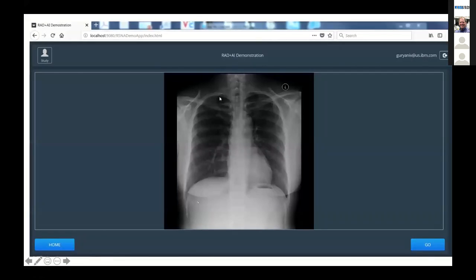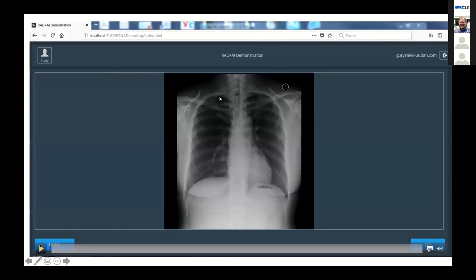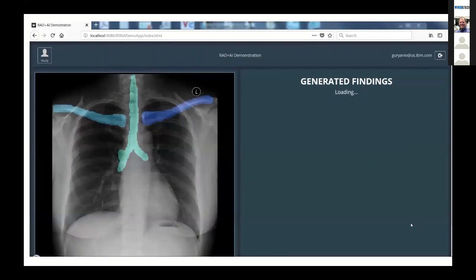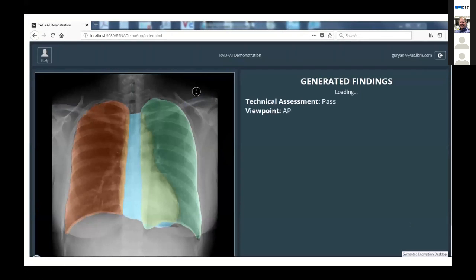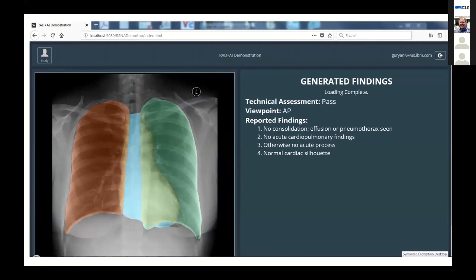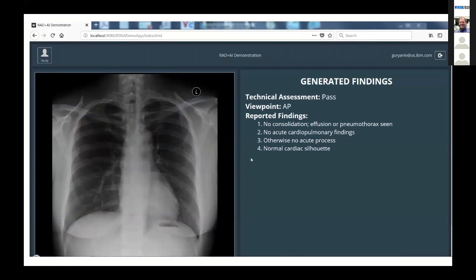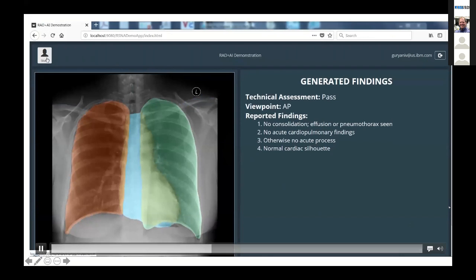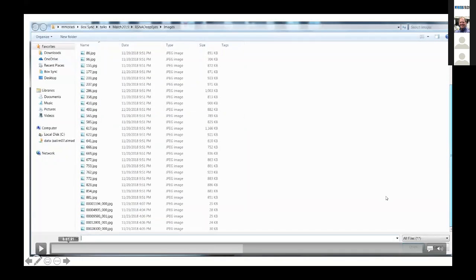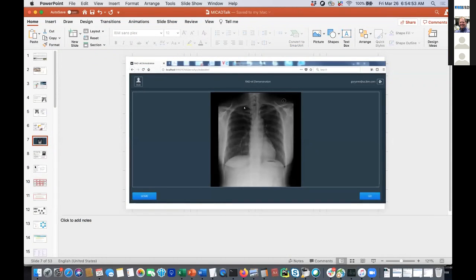Now, just to give you a sense of the type of capability we reached, you can see a bit of a demo here. I don't know if people are able to watch this video, but here's an image. You just feed it to the service, and the image is analyzed and a report is generated here. You can do this by picking any of your images from your PACS and submitting them to this service and producing a report as such. So in the interest of time, let me move on to the rest of the deck.